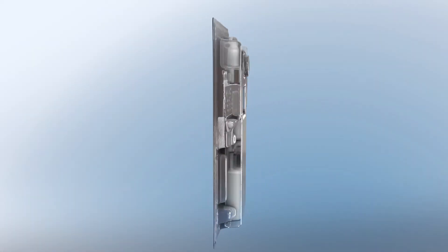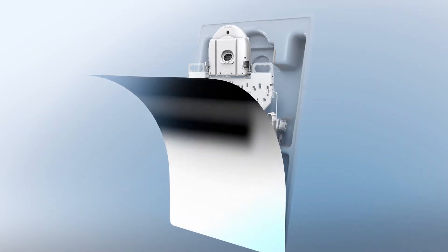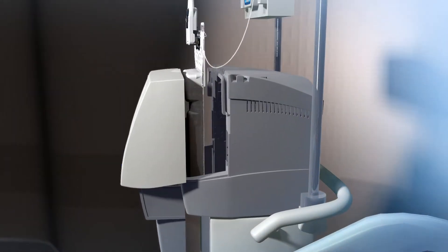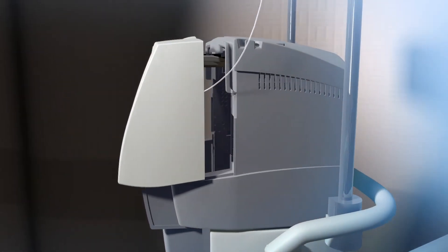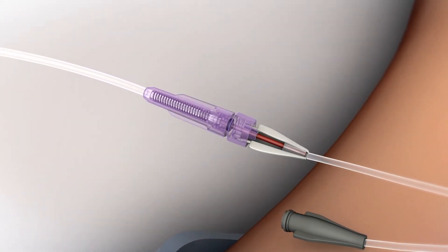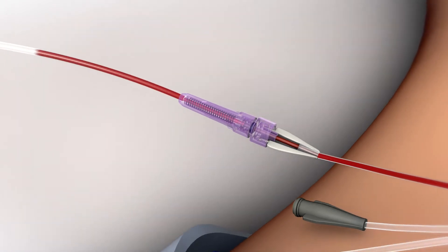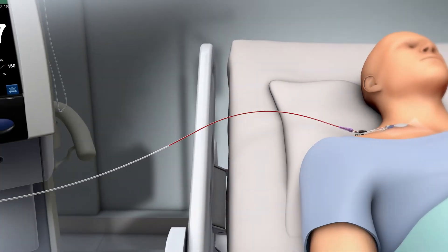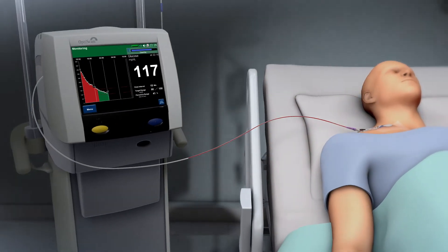The system includes both the device itself and a sterile single-use disposable cartridge, which is the only point of contact with patient blood. A proprietary universal patient connector seamlessly attaches the disposable cartridge to the patient's venous access catheter, ensuring blood flows smoothly, eliminating the need to heparinize the patient.